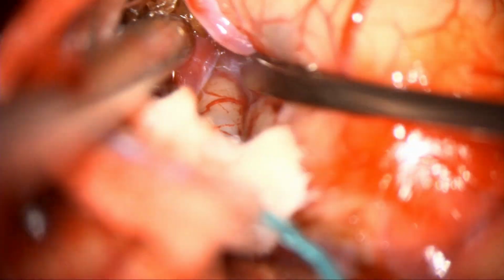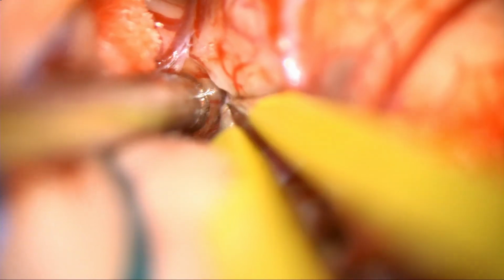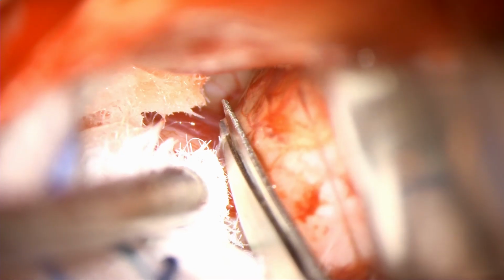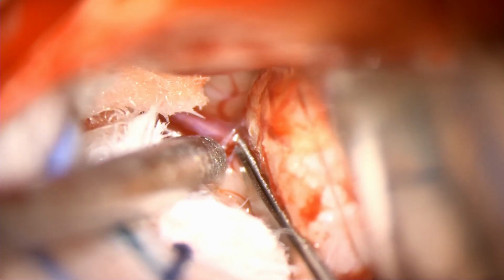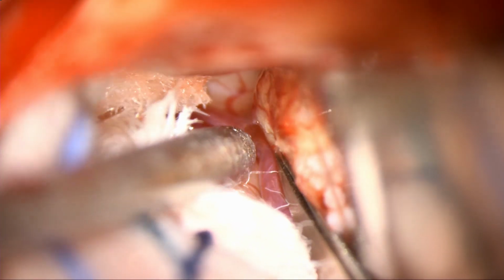Here, once again, demonstrating tough arachnoidal adhesions and a combination of blunt and sharp dissection, but mostly sharp dissection to separate the temporal and frontal lobes. As we continue to separate frontal and temporal lobes, we start seeing more of the middle cerebral artery branches. This is an unusual anatomy because of the large anterior temporal branch, and therefore dissection has to be very clear.